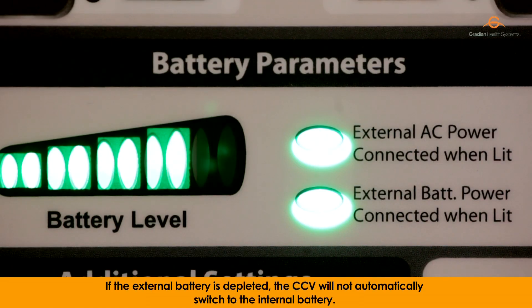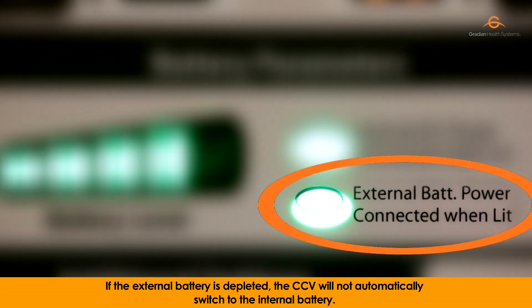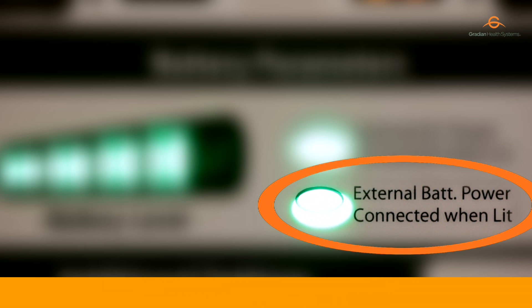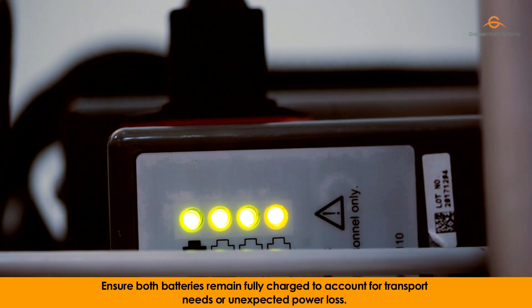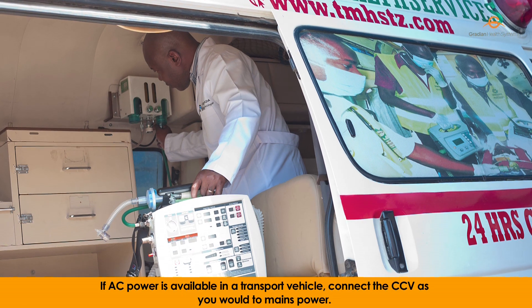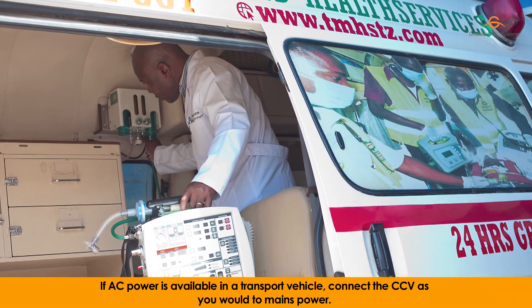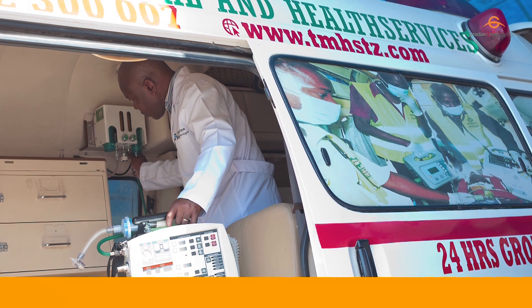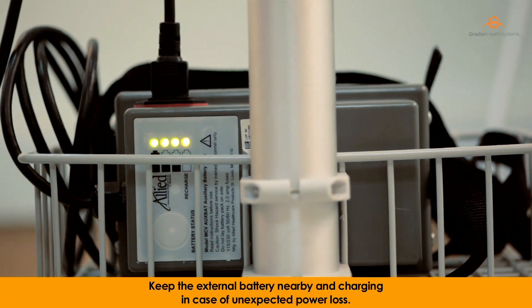If the external battery is depleted, the CCV will not automatically switch to the internal battery. Be mindful of this when planning power needs before and during transport. Ensure both batteries remain fully charged to account for transport needs or unexpected power loss. If AC power is available in a transport vehicle, connect the CCV as you would to mains power. Keep the external battery nearby and charging in case of unexpected power loss.